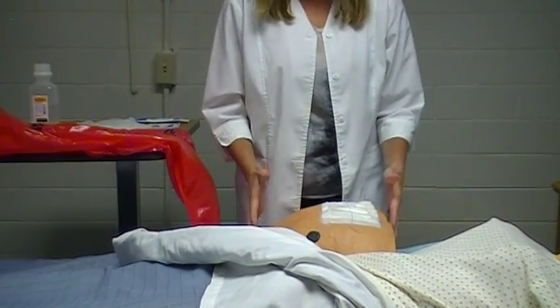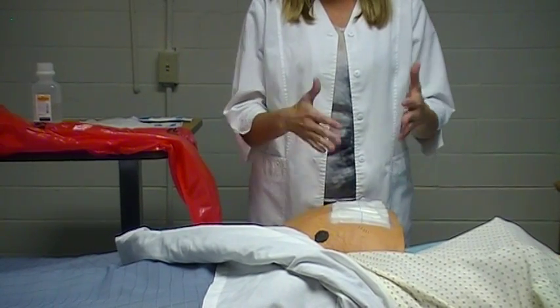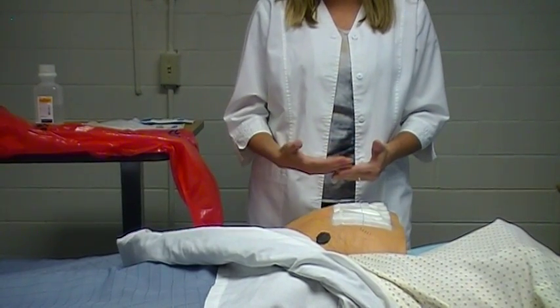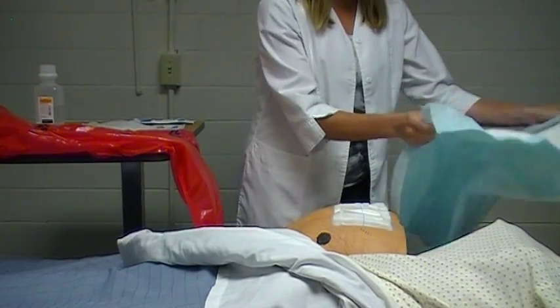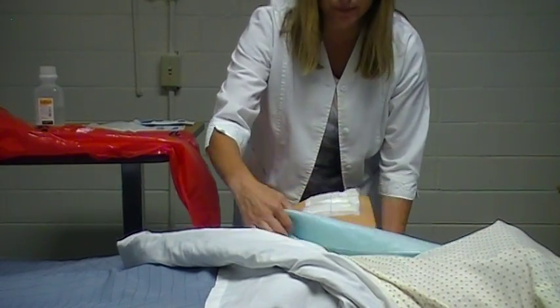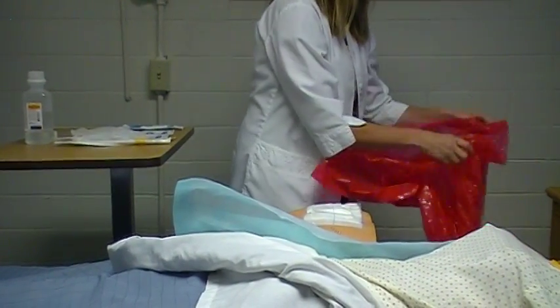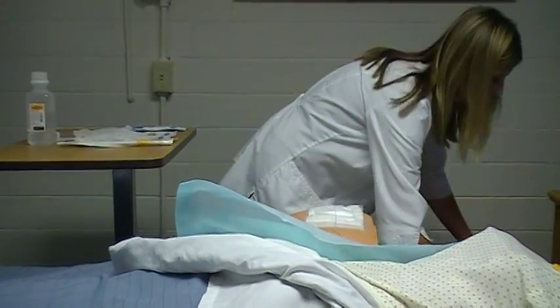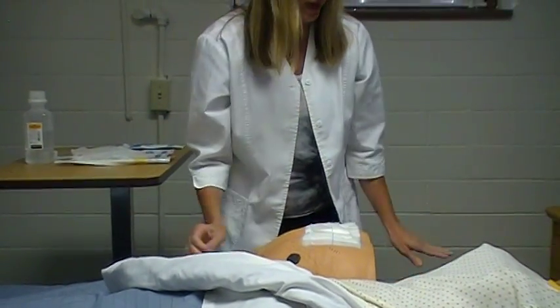Now, if we were doing this on a real patient, more than likely we would have them in a Sims or lateral position in order to access the wound. Most people won't tolerate being in the prone position, so you would probably have them in their side lying position. But for this skill, and so you guys can see what we're doing, we're going to put the waterproof pad under them. We're going to take the biohazard bag and put the biohazard bag in the trash can.